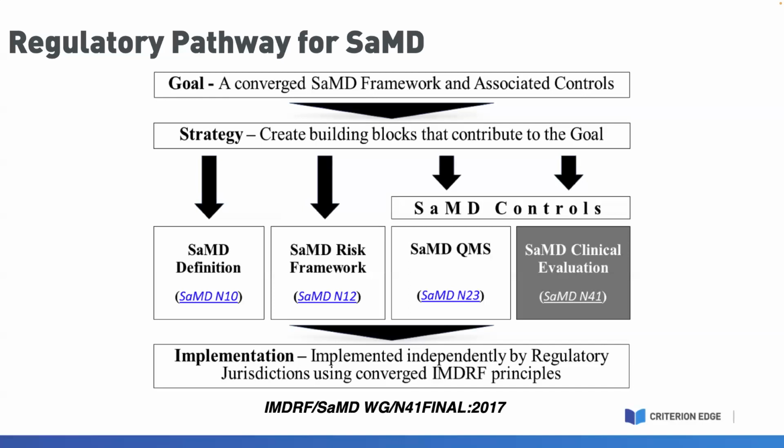Ultimately, the healthcare decisions are going to rely on information provided by the output of software. And these decisions can impact clinical outcomes and patient care. And that's really why the global regulators are expecting that the performance metrics for a software should meet the same level of scientific rigor and are also dictated by the level of risk and the potential impact of that software to affect clinical care. And our goal then is to demonstrate and reassure the notified body of the safety, effectiveness, and performance of the software in particular.